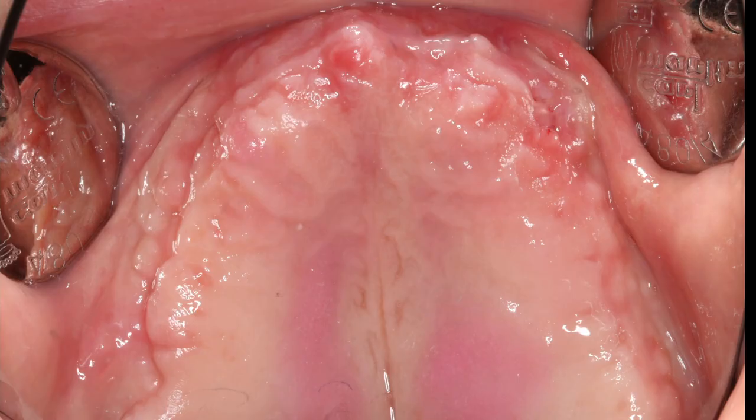Now you can see the healing after 20 days. We have to wait about six months, and then comes the re-entry.